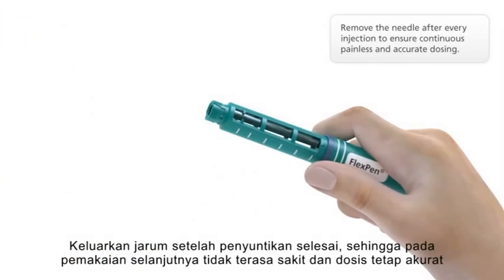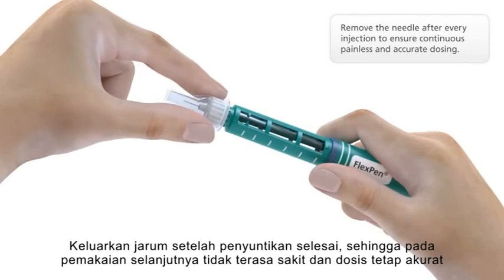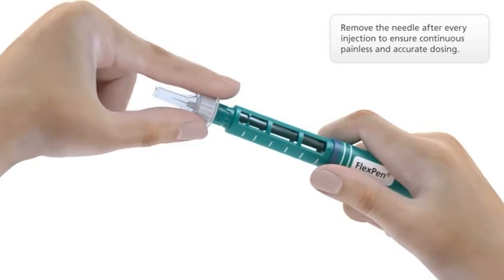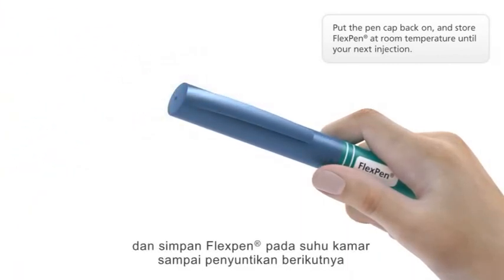Remove the needle after every injection to ensure continuous, painless and accurate dosing. Then put the pen cap back on and store FlexPen at room temperature until your next injection.